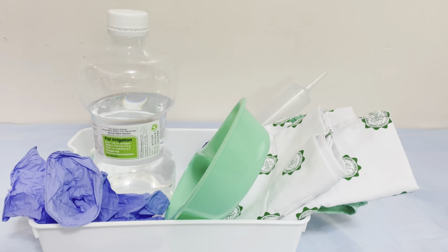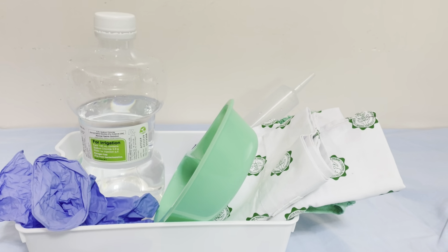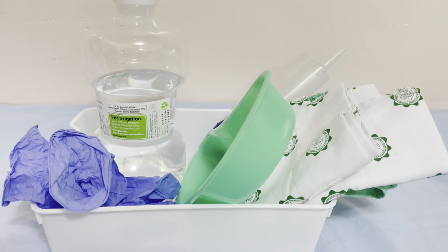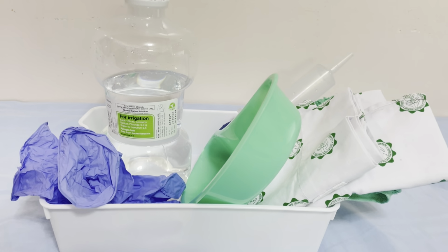As part of our assessment, we have to gather and prepare all the materials that we need in this procedure, including the solution. We have to make sure that the solution or the fluid is at room temperature. This is to save time and effort. The materials that we need for this procedure are the following.